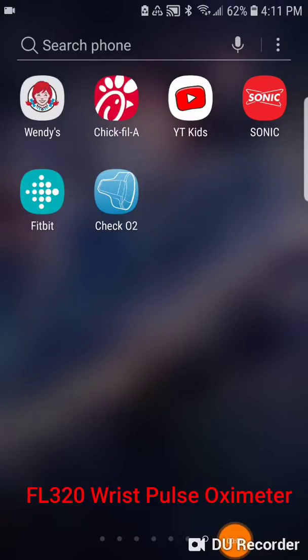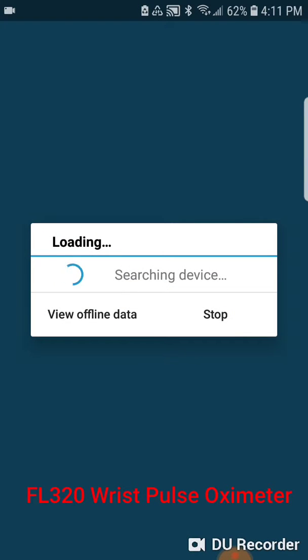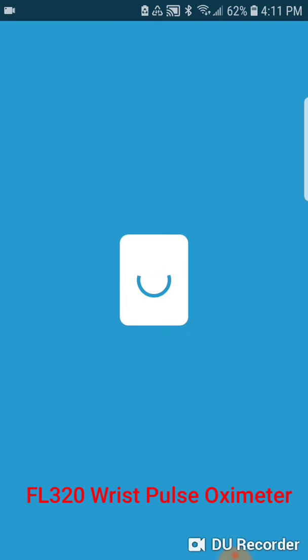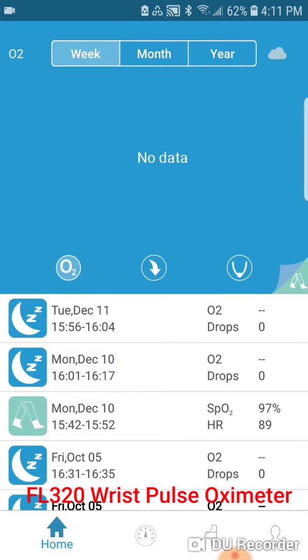Today we will be reviewing how to see any recorded data from the Facelake FL320 Wrist Pulse Oximeter to the CHECK02 application. With the application downloaded onto your phone and the Bluetooth on, please go into the application, at which point it will connect to any device that was previously connected to the application, and it will give you four options.